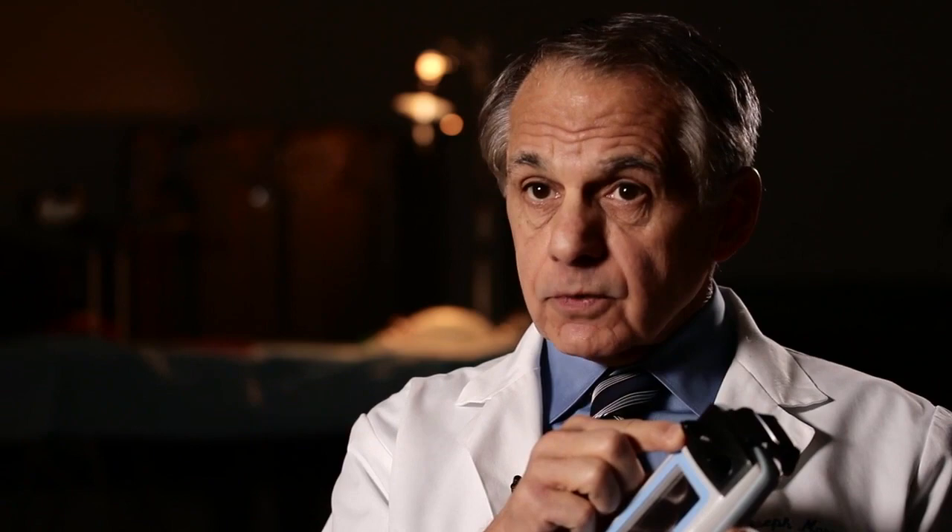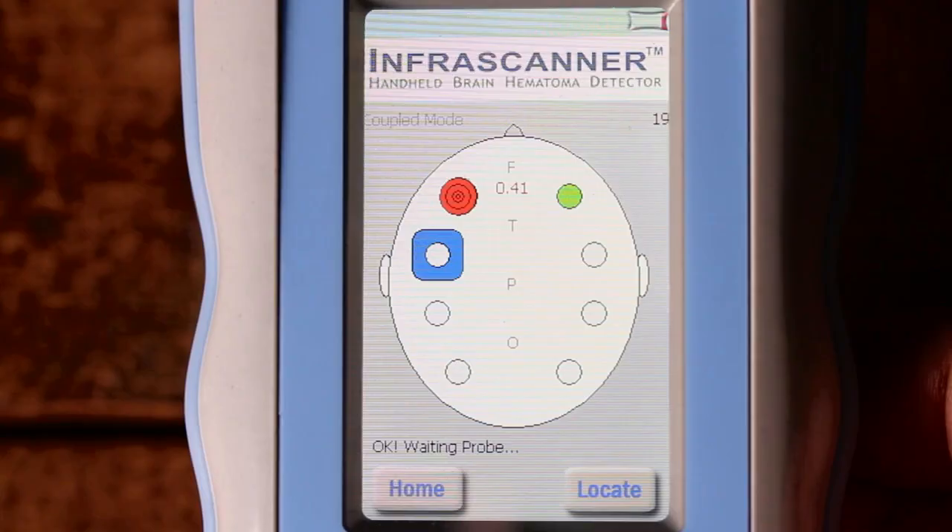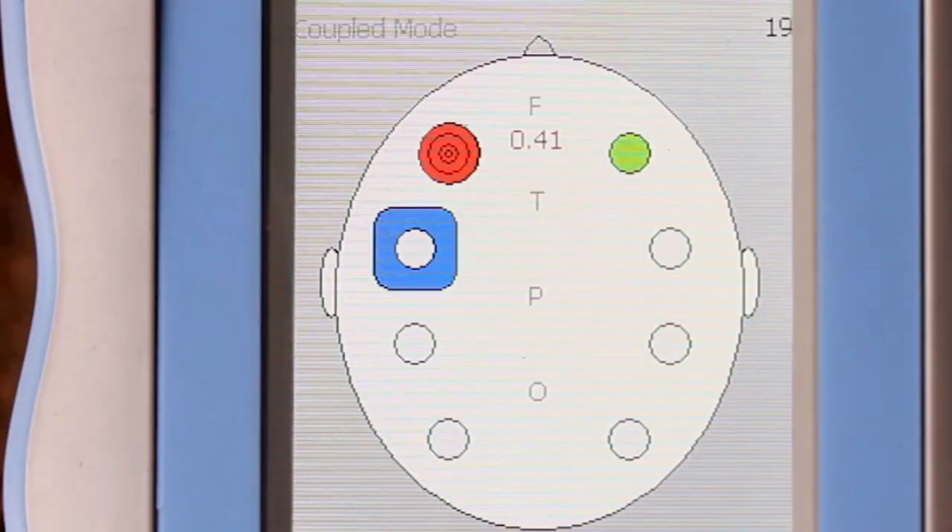The Infrascanner is a handheld lightweight system that uses a disposable fiber optic shield for patient interface. It uses near infrared technology to detect intracranial bleeding. It provides a simple positive-negative report that helps to identify those patients who may need immediate referral for a CAT scan and/or neurosurgical evaluation. The Infrascanner can detect a hematoma of 3.5 cc's in volume at a distance of 3.5 centimeters from the scalp surface.